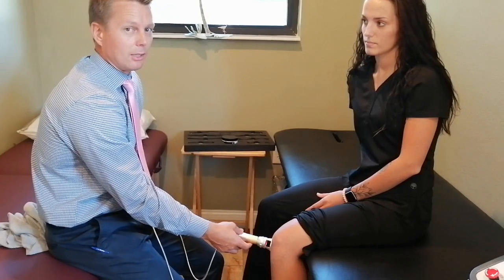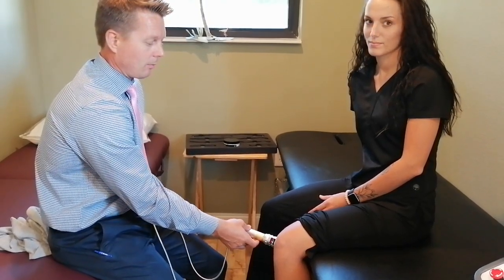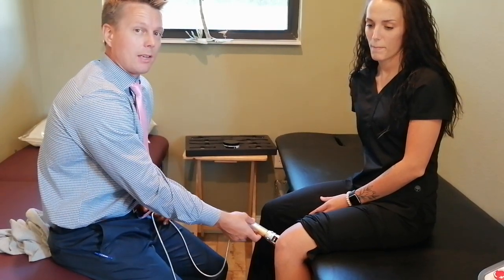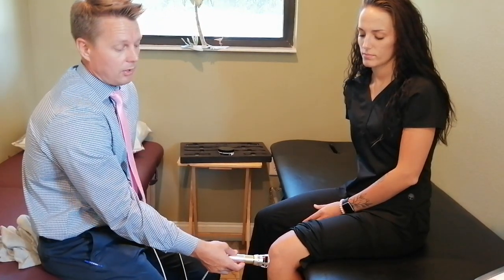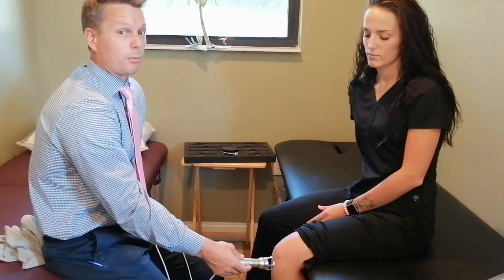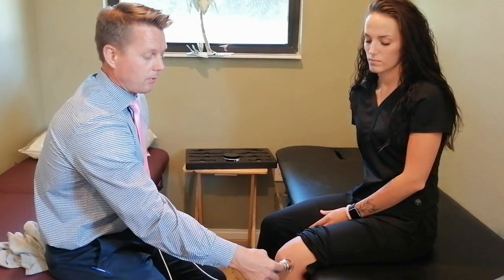It's going to speed up healing at a cellular level — the mitochondria are going to work faster and harder. The treatment lasts about seven to eight minutes per region, per area. Typically the patient doesn't feel anything until afterwards, and the results are typically pretty quick. Within a matter of a few treatments, people are noticing a difference.